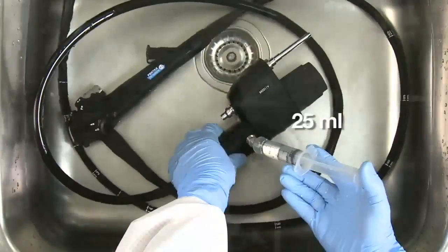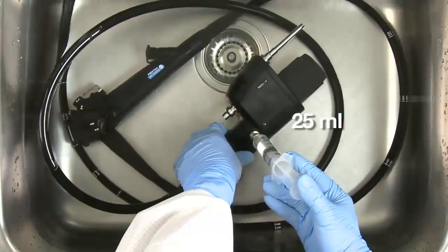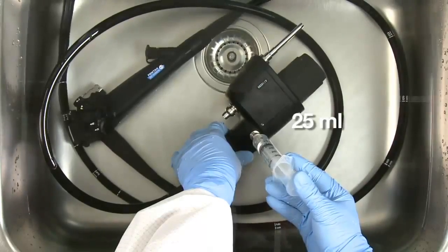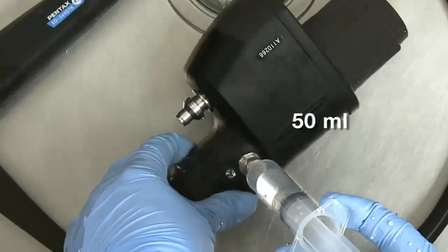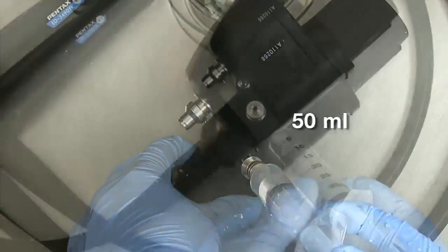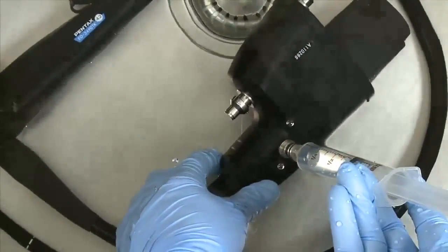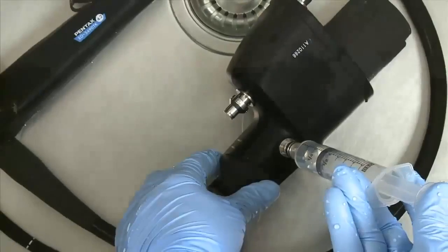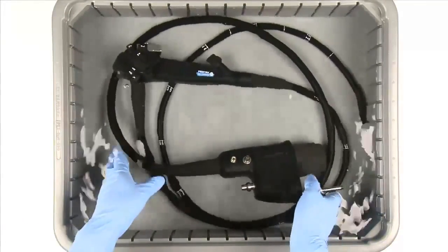Fill a 60 cc Luer lock syringe with 25 milliliters or more of the same solution and flush the air-water channels. Finally, flush 50 milliliters or more of fresh solution into the suction channel. Repeat the previous 3 steps with the syringe filled with air to purge the diluted enzymatic solution out of the channels. Drain the basin or transfer the endoscope to clean rinse water.